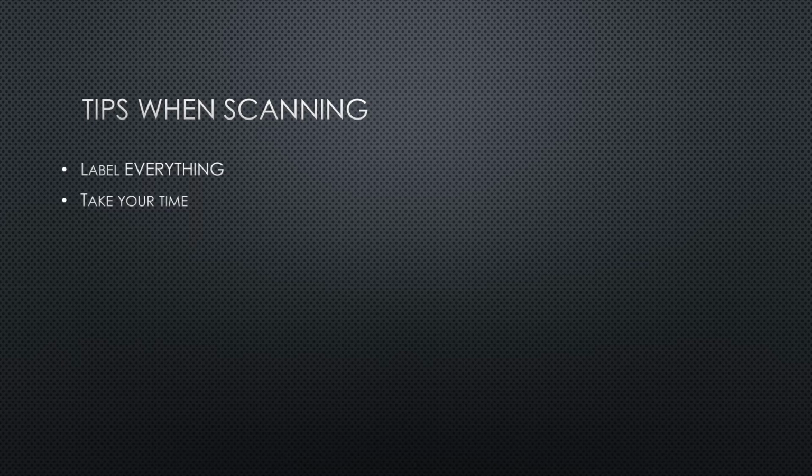Right? Especially if you don't have me or one of the other ultrasound faculty helping you out, you really want to take your time when you're doing your scans, and make sure that you use whatever references you need to. We've got tip sheets that are attached to some of the ultrasound machines that you can use that'll tell you how to do what you need to do and how to improve your imaging. So reference all of that stuff. You've got 5-minute sono videos that you can reference to have a quick guide to make sure you're doing things correctly. So just really take your time, and do it right.